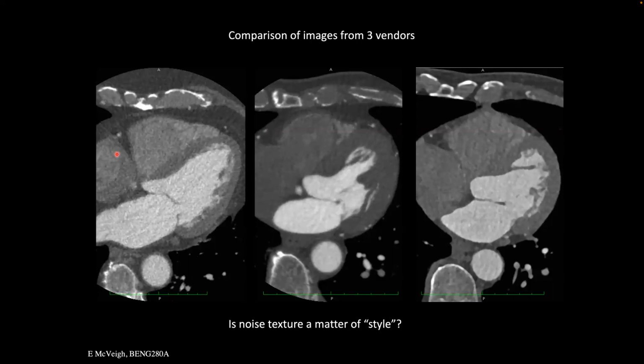It comes off the aorta and then wraps around the back wall of the heart. And you would like to measure the diameter of that object, right? Or visually, you would like to determine whether or not that little circle has a changing diameter as you move through it. Does it thin down and then come back? And if it thins down and comes back up, that means it's coronary artery disease, right? And so that's an object that is looked at a lot in cardiac CT scans like these.